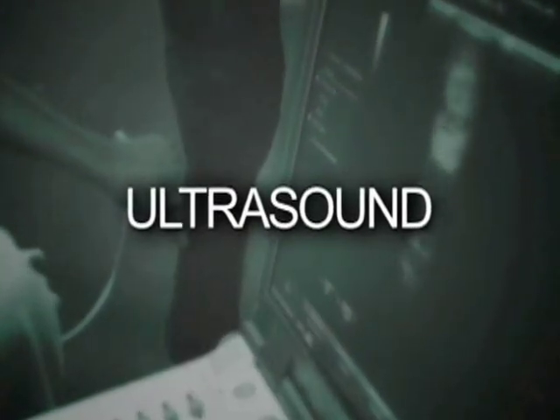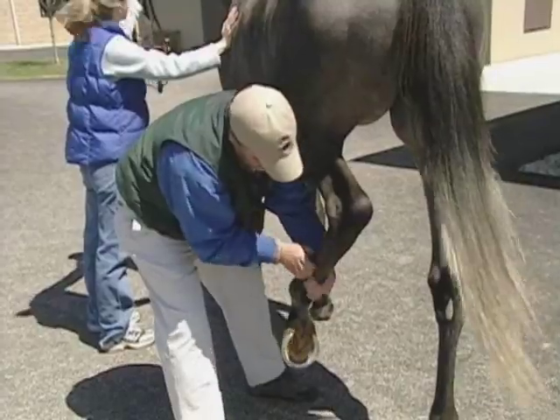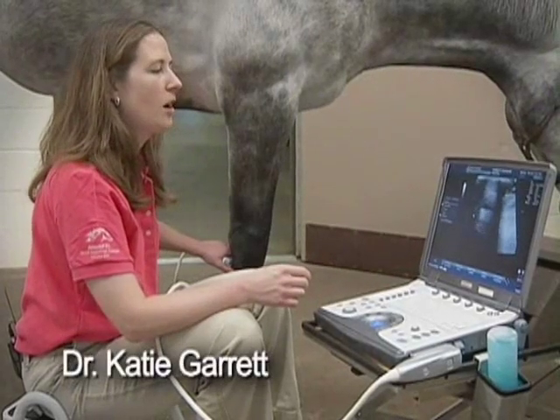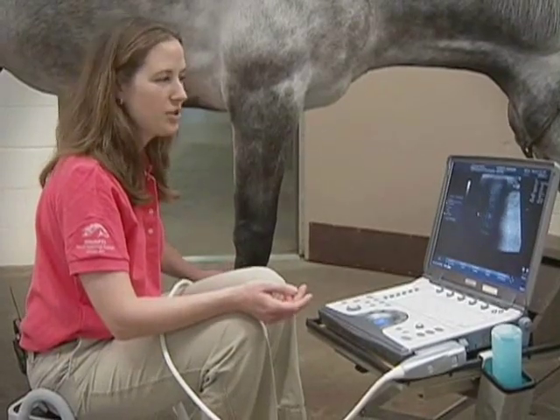Right here, that's normal — that's what we'd like it to look like. Ultrasound is particularly good for soft tissue types of problems: tendons, ligaments, those sorts of things. So what I'm looking for are any areas where they might be torn or have a little bit of inflammation, some tendonitis.